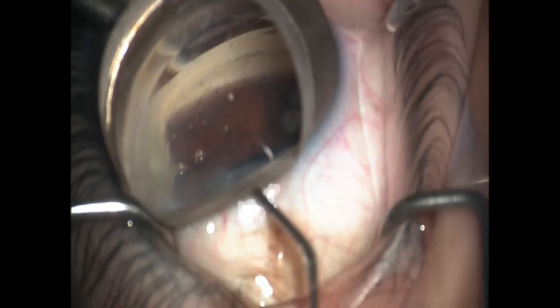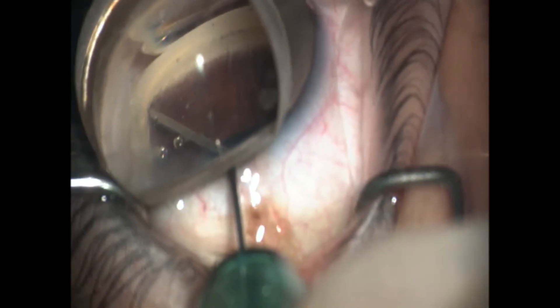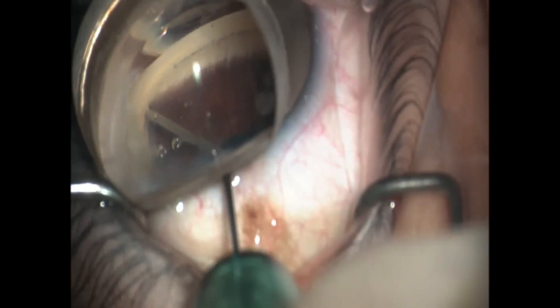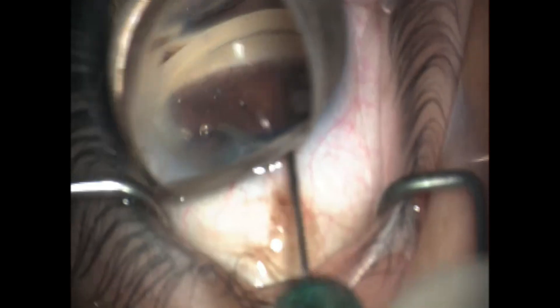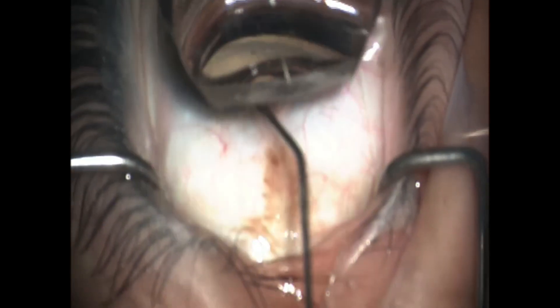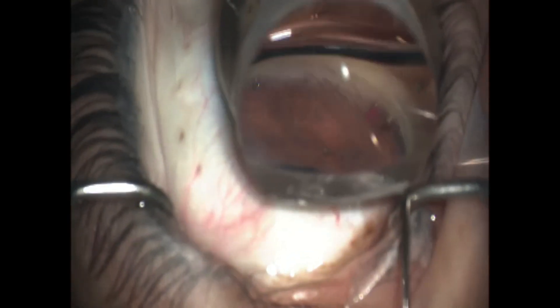It looks good. I'm going to check all my stents one more time. With visualization it looks good — it's not moving, it's nice in position. I'm tapping it very gently to make sure it truly is lodged in place, and here they all look good. I'm going to go in with the viscoelastic injector and just prove on the side that this one's in a good location. You can see that blood reflux, which is what we want to see. And that's a nice demonstration of the new injector for the iStent Infinite.